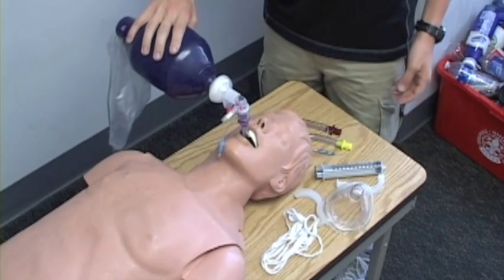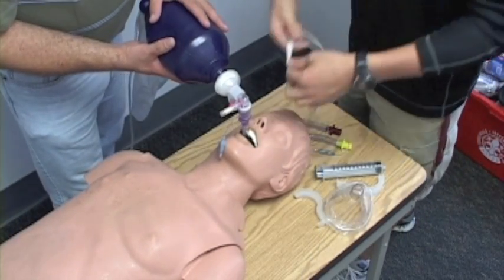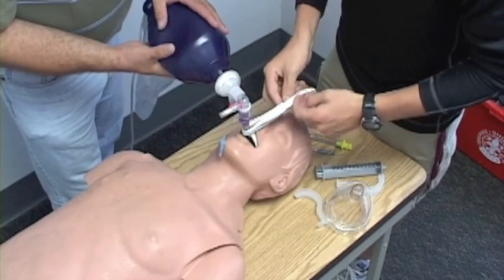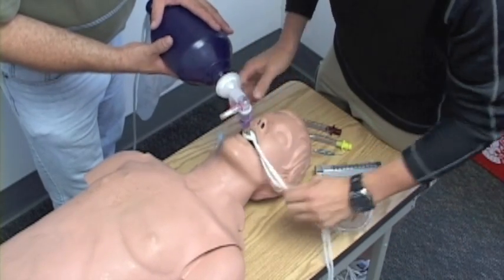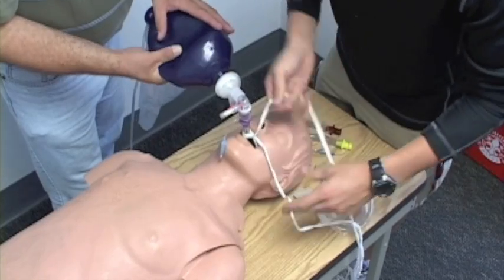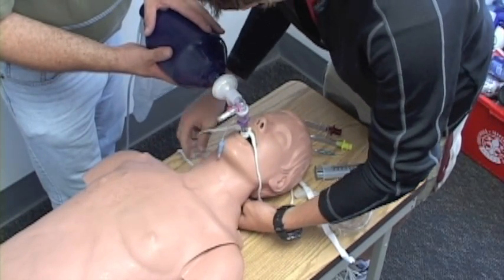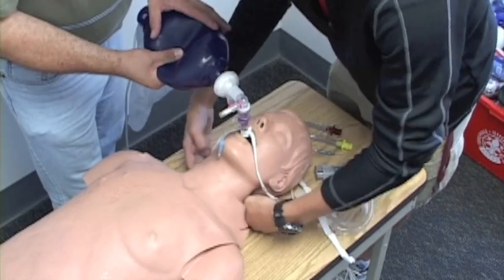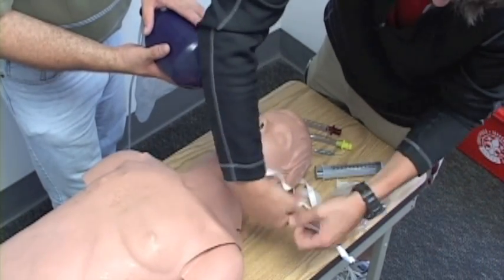I'll go ahead and use a capnography device to detect CO2. I'll have my partner continue ventilations on my patient. I'll go ahead and tie off my King airway, going behind the ears, and tie off my device.